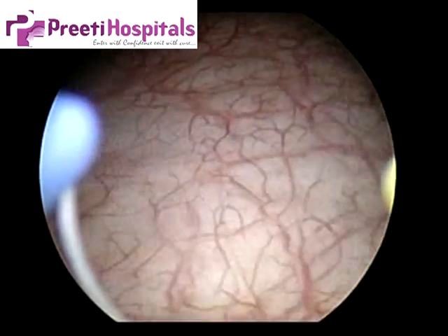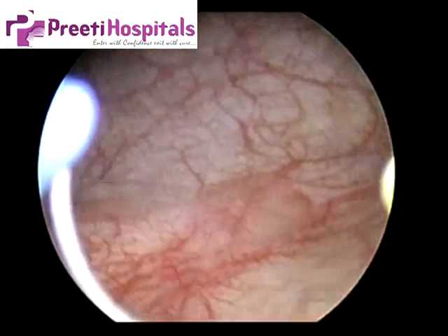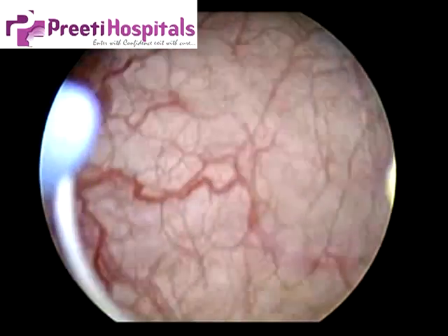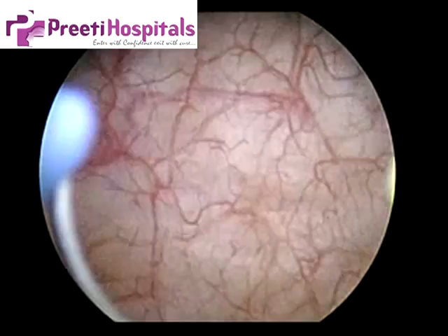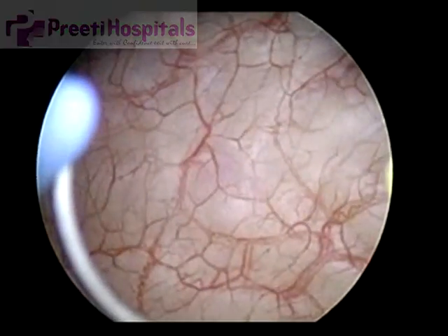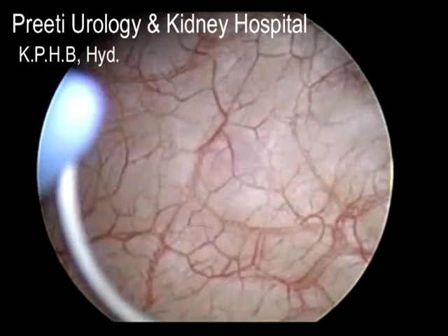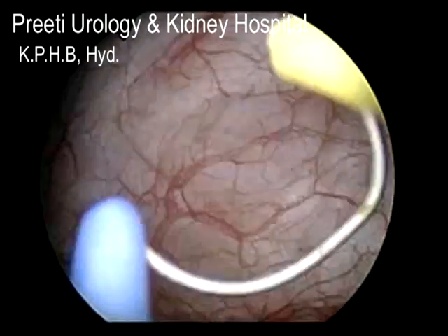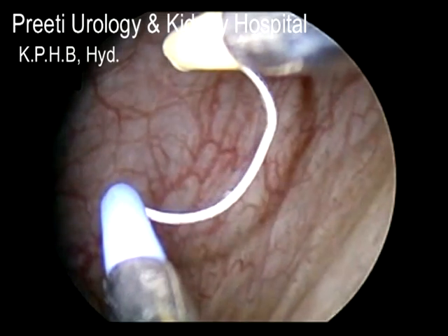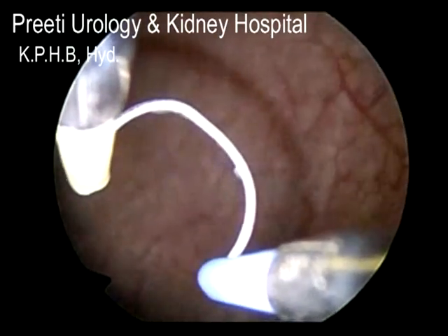The entire bladder we have to inspect. This is the opposite side ureteric orifice. And after inspecting the entire bladder, now slowly we will start cutting the tumor. Now we are inspecting the entire bladder, the left lateral wall, and the anterior wall.